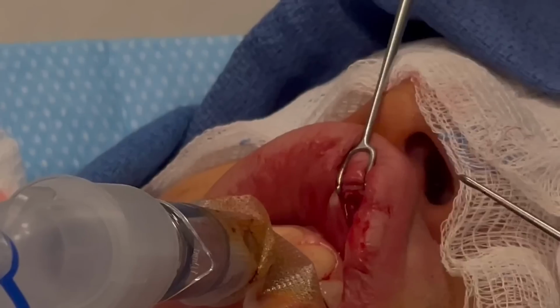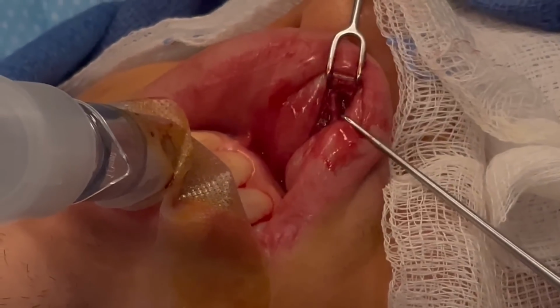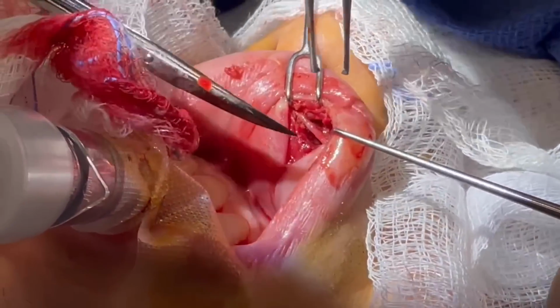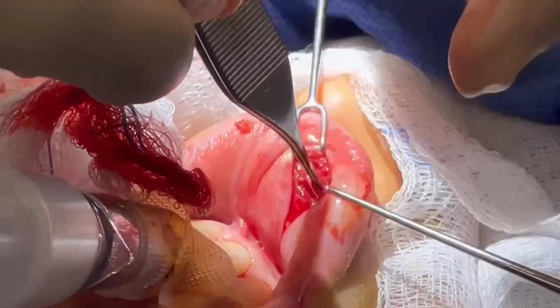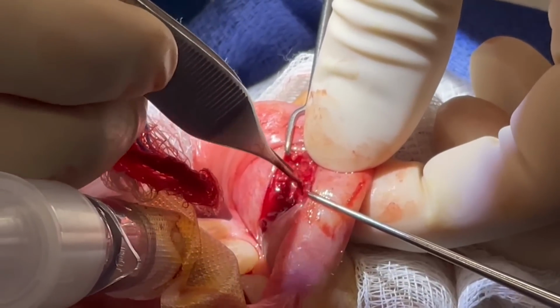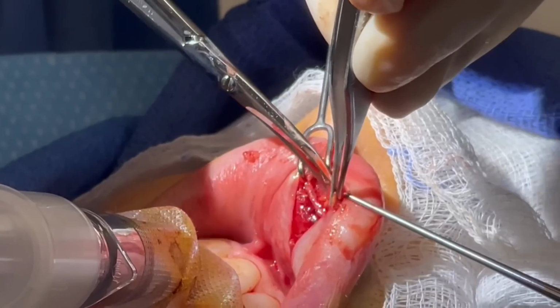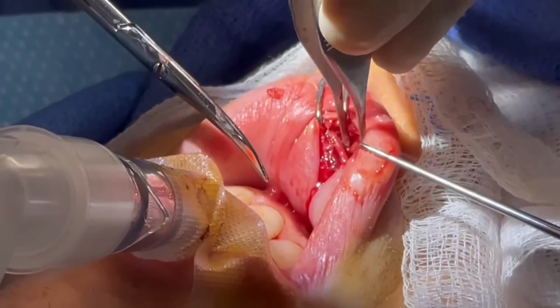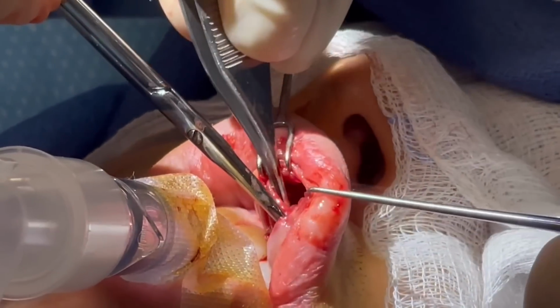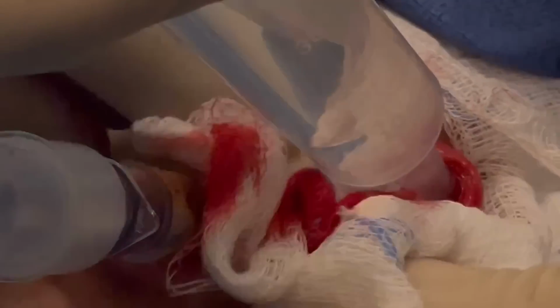Nice. Okay. A little more junk left. And there goes underneath here and there.